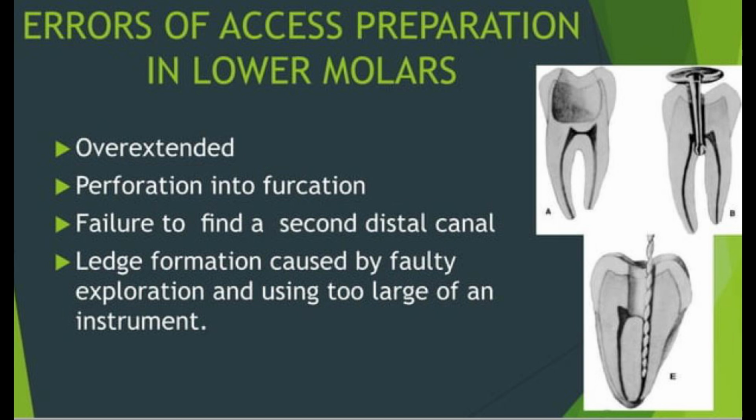There may be errors of access preparation in the lower molars. The access preparation may be overextended. There may be perforation into the furcation area or failure to find a second distal canal, or ledge formation caused by faulty exploration and using too large an instrument.